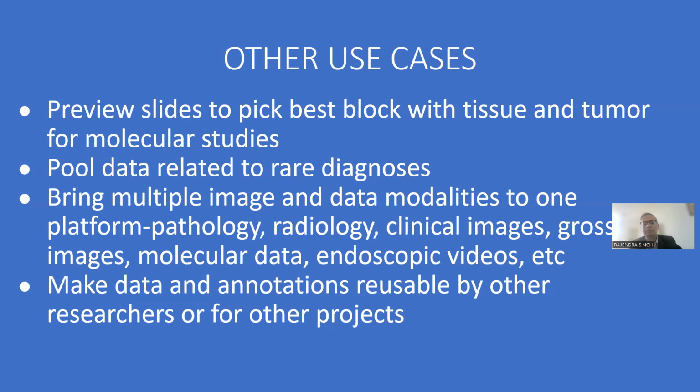Some other use cases of the platform is to pick the best block that has the tissue and the tumor for molecular studies, because many times we get a block that doesn't have any tissue or tumor in it. So if you have the ability to preview the whole slide image and then pick the block, that would save a lot of time.